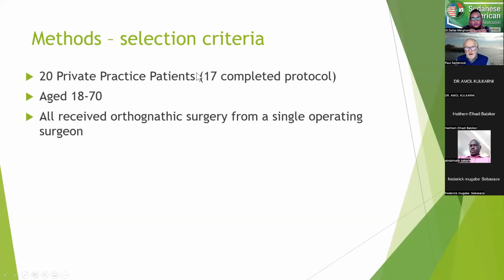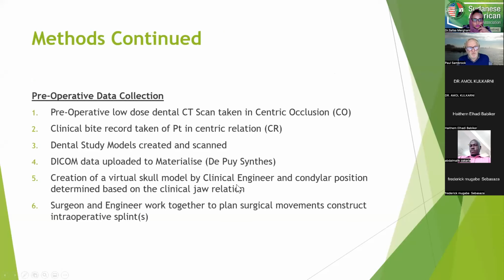We had 20 private practice patients. 17 completed the protocol. 3 dropped out either because they did not wish to have the 6-month or immediate post-op scan, or some other factor. They were just lost to follow up. They were aged 18 to 70. The 70-year-old was a person undergoing jaw surgery for sleep apnea. All received orthognathic surgery from a single operating surgeon. That was one of my colleagues.